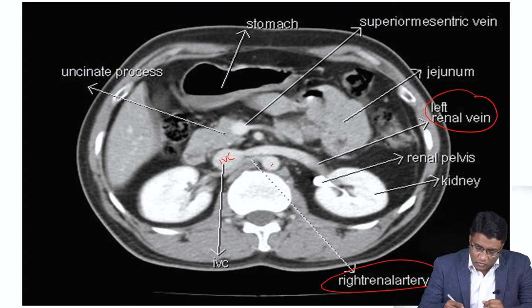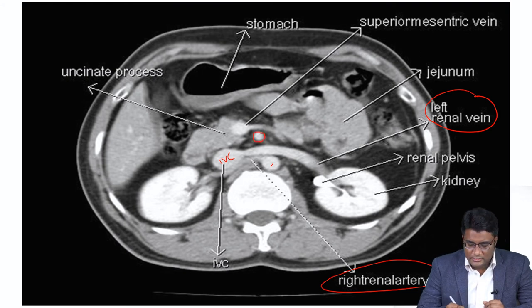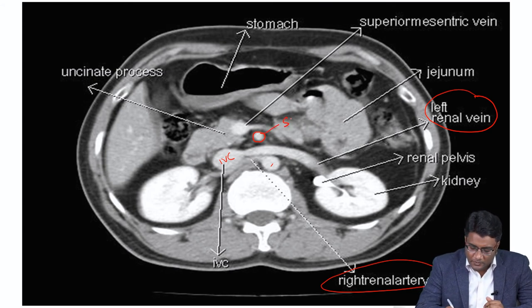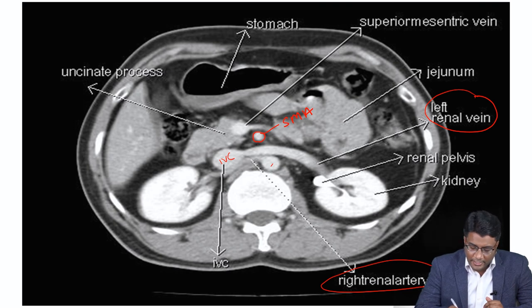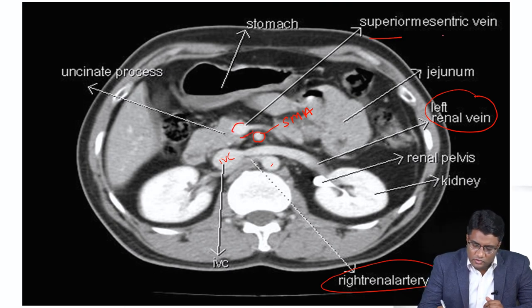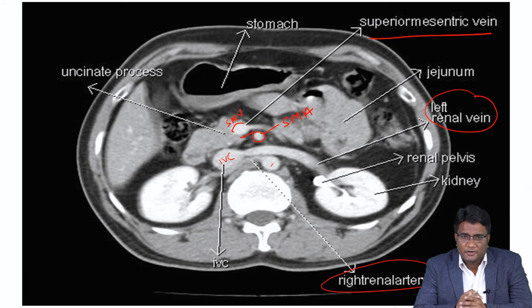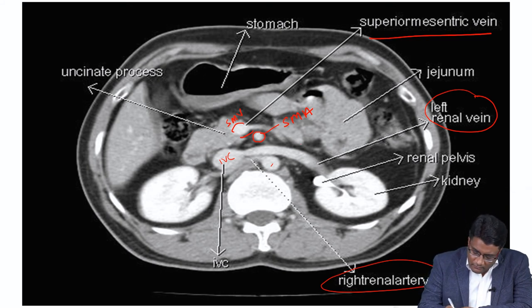Also understand this vessel here — it is a branch of the aorta that has gone in front of the left renal vein. This is your superior mesenteric artery. Towards the right of the superior mesenteric artery, this structure is your superior mesenteric vein. The superior mesenteric vein will always lie to the right of the superior mesenteric artery.